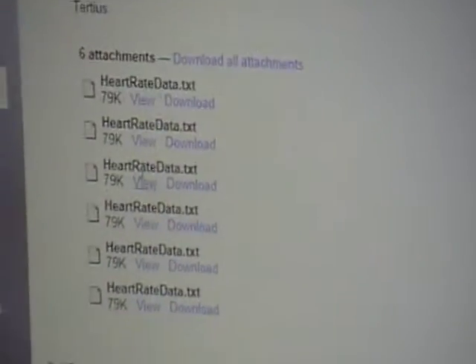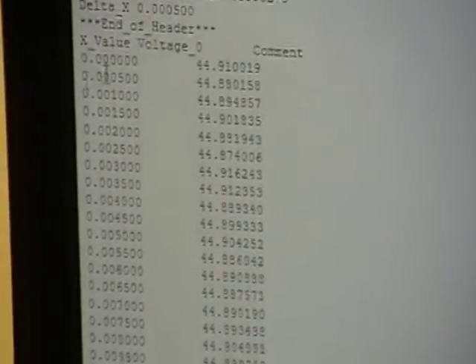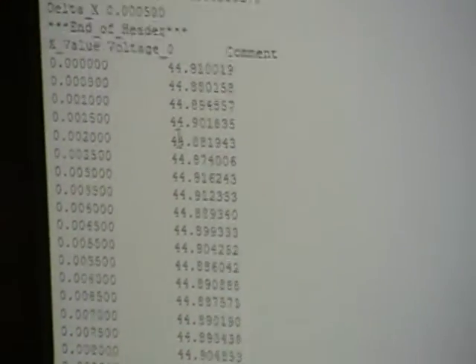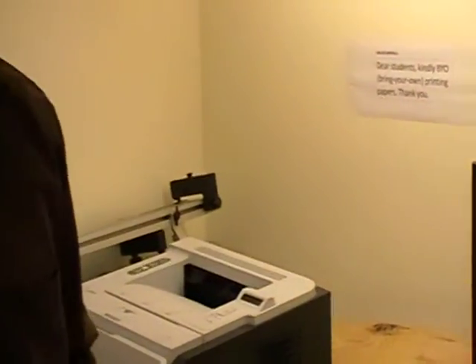There are a few heart rate data information files. So when we view that, you can see that the first value is the time, and the second value is the corresponding amplified voltage. So based on this amplified voltage, we can identify how well the patient's heart is, how much the variability is, and how long the heart rate is varying. These are the basic parameters which can be used to diagnose the healthiness of a heart, doing a heart check, or even for diagnosis of heart diseases like CAD, coronary heart disease.